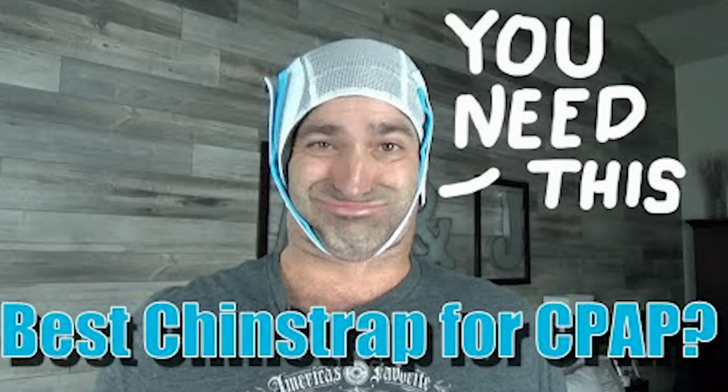I'm not a big fan of the chin straps, to be honest, and that's because if you're going down to something like this, you don't want more crap all over your face, really. Less is better, all right? But if you want to, you can try a chin strap. The Knightsbridge chin strap looks like you've got a great big jock strap on your head. They're probably the best, but there's a fair bit to them.